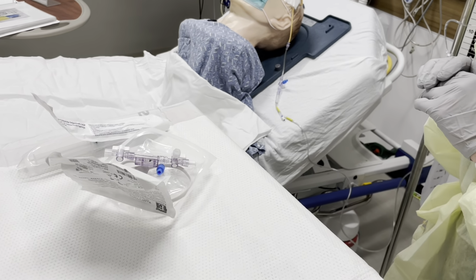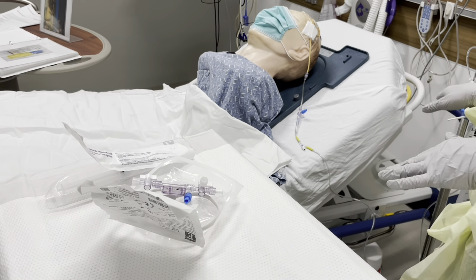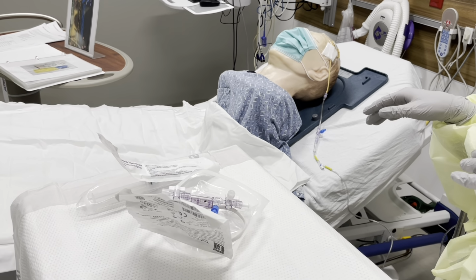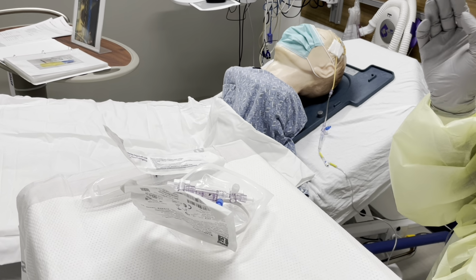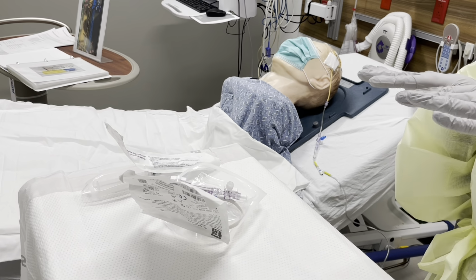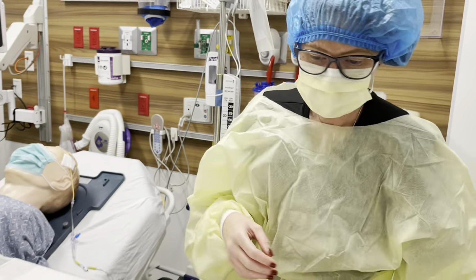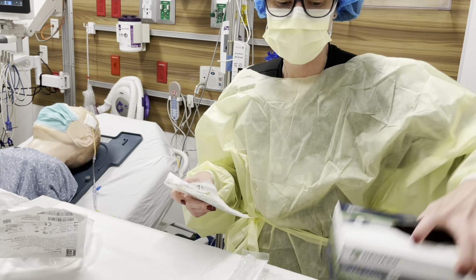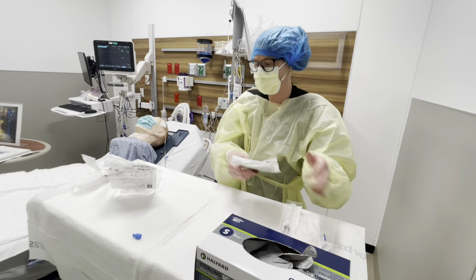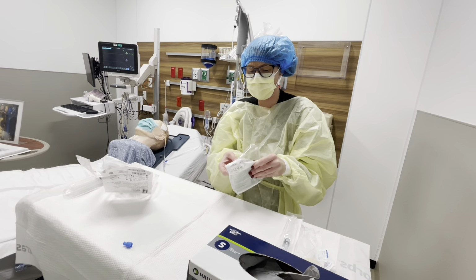Now, since we are pretty much all ready to go at this point, we can grab a friend, because there are going to be certain things over here that are not sterile that we're going to be touching. But for right now, we're going to put on our sterile gloves, because we're going to start manipulating the transducer. So we'll take these off, our sterile gloves.